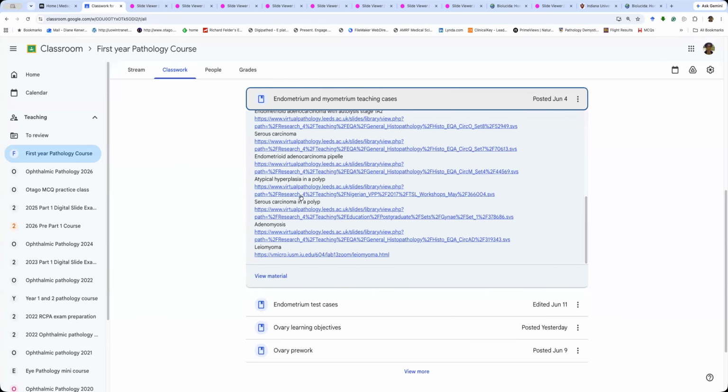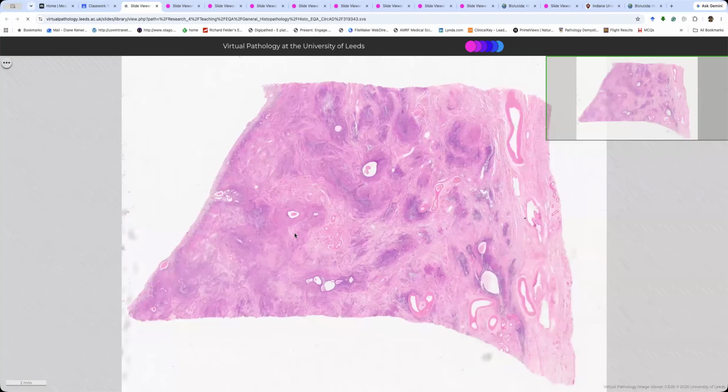Okay. Right. Adenomyosis. I'm sure you're all pretty familiar with adenomyosis, aren't you? Yep. So here's a nice example. Adenomyosis is only a problem for us when we've got atypical hyperplasia and invasive carcinoma because it messes up the measuring. So if you've got atypical hyperplasia becoming carcinoma here, that's invading. You still apply the same rules of measurement, okay?